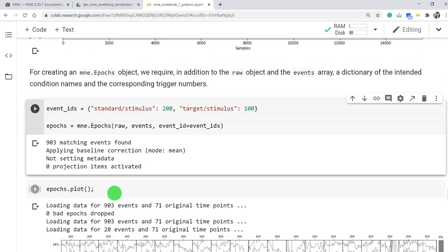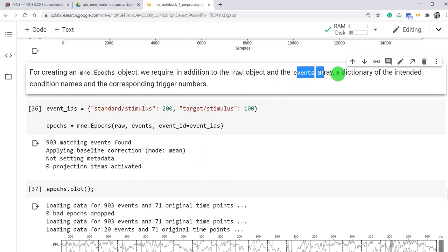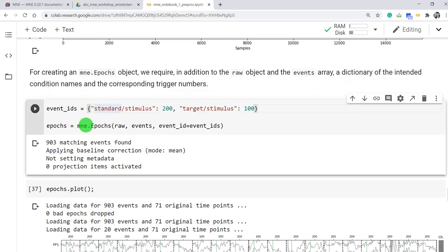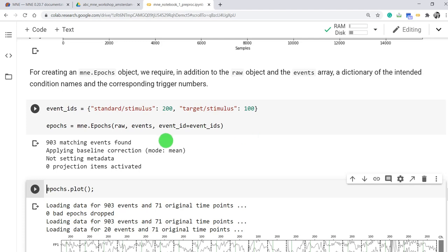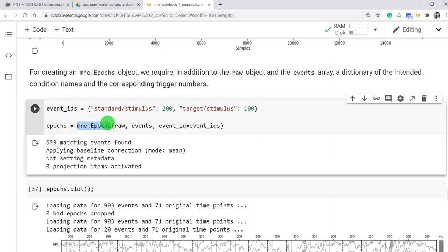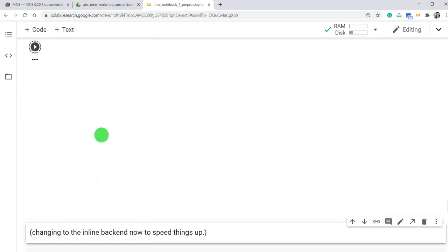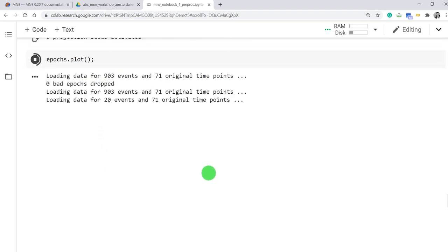So we need to do some steps. A MNE epoch object, which we'll be using for segmenting, requires events array and a dictionary of the intended condition names and then corresponding trigger numbers. So we need to pass raw continuous data, event array, numpy array that contains, and event ID. We can give name to event ID as standard stimulus, target stimulus. Let's try. So we just segmented continuous EEG data using MNE epochs into segmented trials. Now we can visualize, try to plot those segmented data.